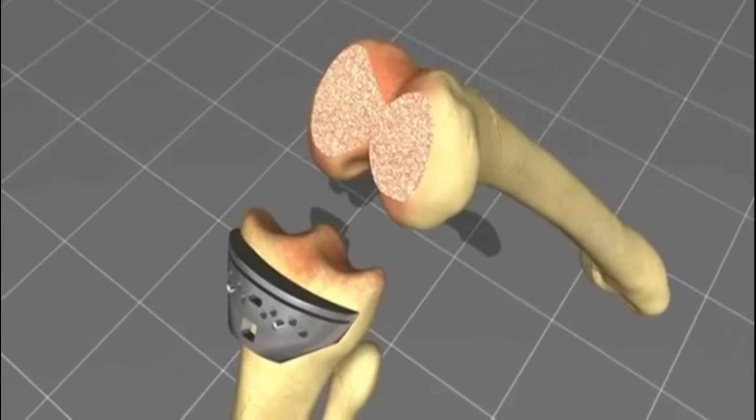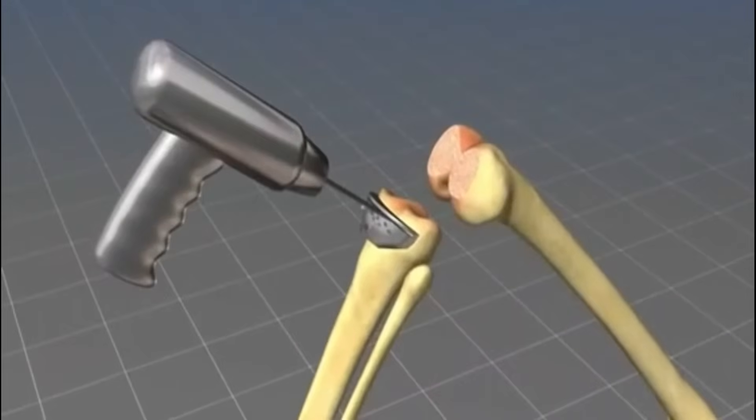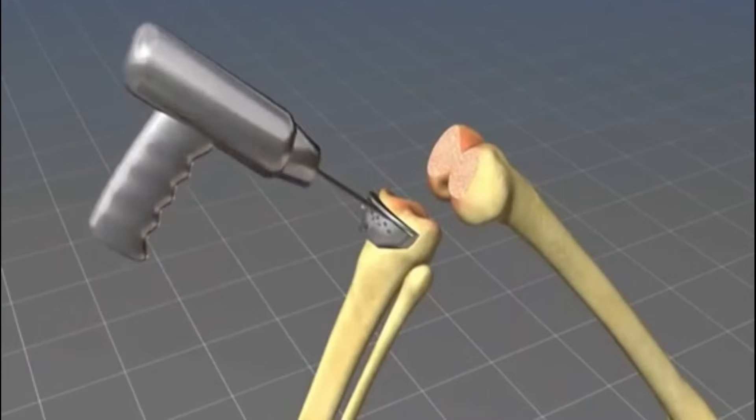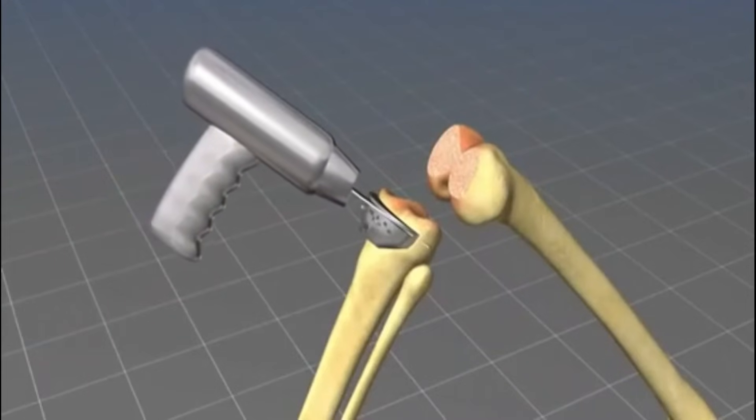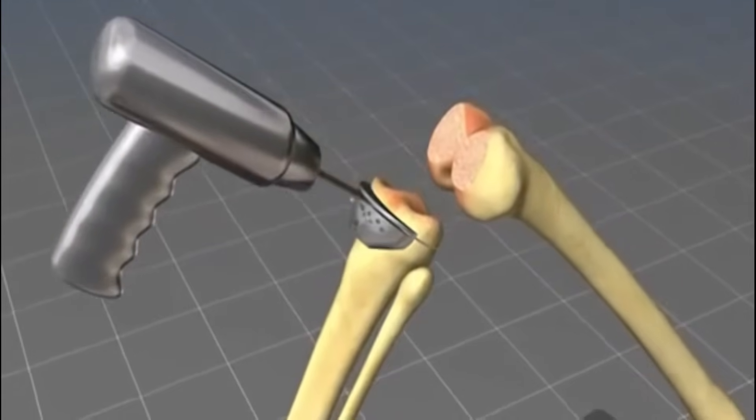The same surgical step is then performed on the tibia. Also here, exactly that amount is taken off the cartilage and bone, which is later replaced by the tibial part of the prosthesis.